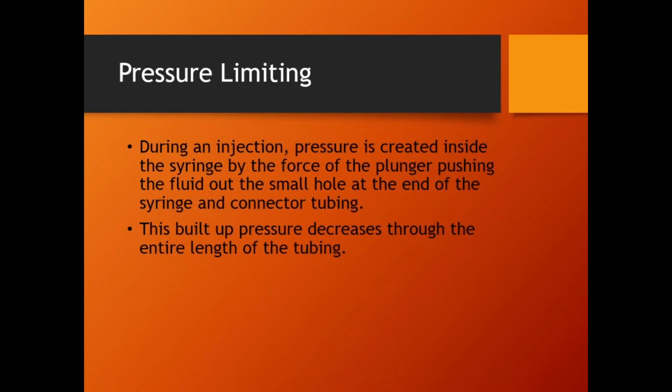All right, now the first 2, flow rate and volume. We're all experienced BMETs. I think everybody understands flow rate and volume. All right, even a non-BMET, flow rate and volume. Okay. Now the pressure limit. Basically, we're going to tell the system, all right, the typical pressure limit for a CT injector is 300 psi. And what that means is we're telling the system, do not exceed 300 psi in the syringe. Now that's the important thing. That is not the pressure that gets to the patient. Okay, that is the maximum pressure we will allow in the syringe during the actual injection.